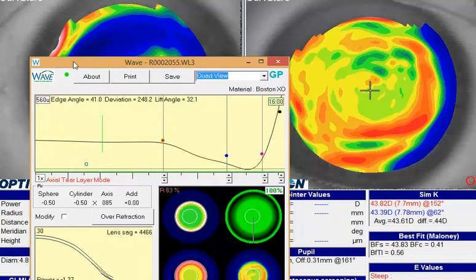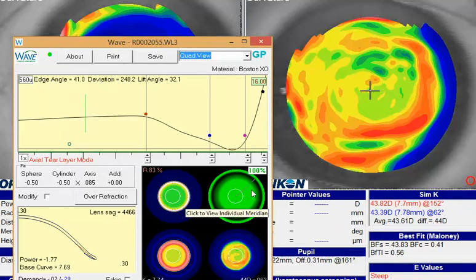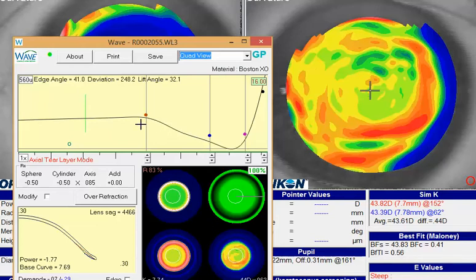If we look first at the right lens, it sounds like it's fitting fairly well overall. If we look at your design, you do have a little bit of a quick steep slope here coming into the landing spot, which is at about 13.4 millimeters.